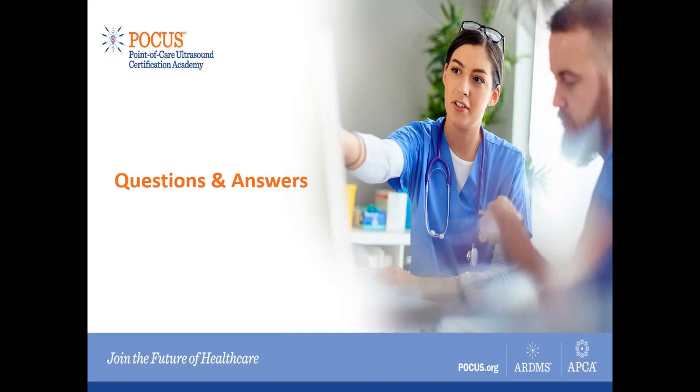If that happens, you might want to reschedule the patient and try to have the patient fasting and then look. If you still don't see it, then of course you have to consider sending to radiology, and they can perform an ultrasound exam with their high-end ultrasound systems. If that doesn't work, then they will do a CT scan. But if the patient needs an emergency ultrasound, then of course we're not going to reschedule, we send straight to radiology and handle that. So that's the sequence of events.